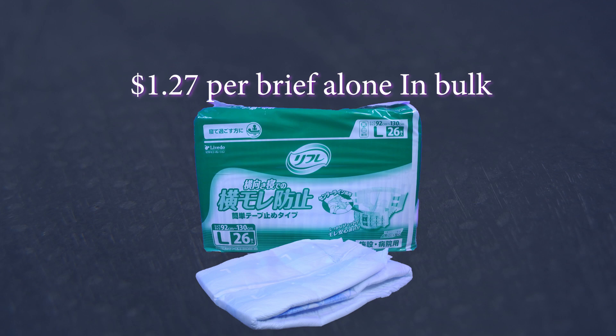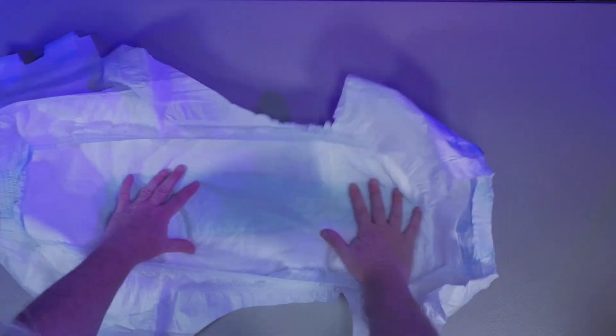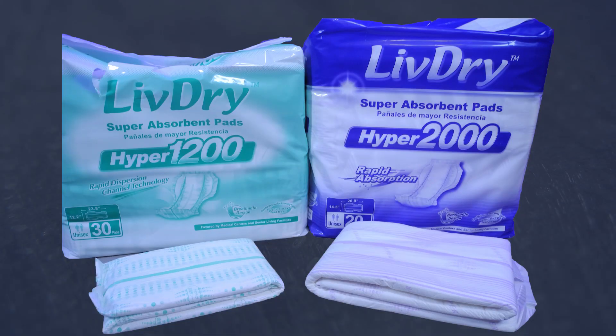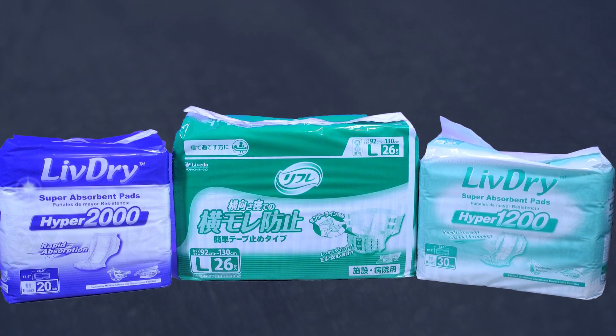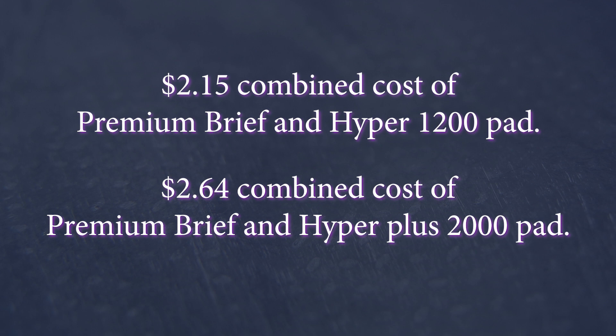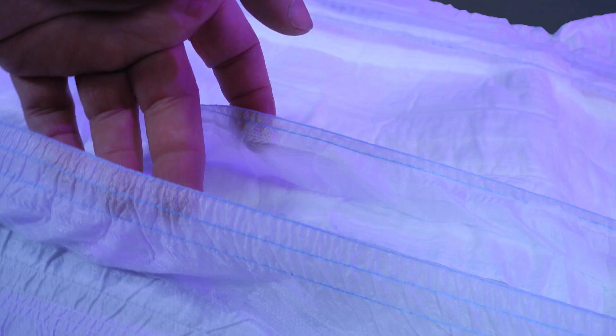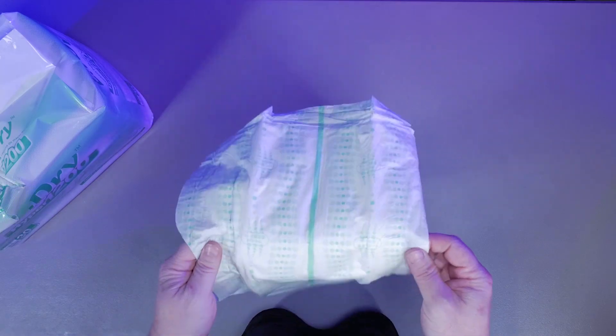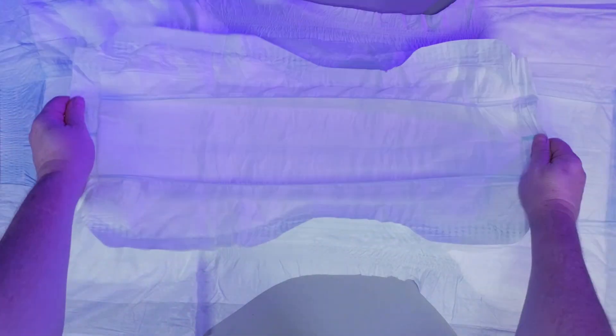At $1.27 per brief alone, the brief is lacking in absorbency and the top sheet limits its comfort. Besides the overall high quality construction and materials, it is not very usable on its own. Adding a Hyper 1200 or a Hyper Plus 2000 booster greatly improves the system's performance as designed. At $2.15 for the combined premium brief and Hyper 1200 booster, and $2.64 for the combined premium brief and Hyper Plus 2000 booster, we find a value proposition issue. High quality materials, manufacturing, and a unique design can overcome the few flaws that ultimately limit the system's performance. Improving the top sheet and adding adhesive strips to the pads, as well as bringing the cost per combination in line with the competition, will greatly improve this incontinence system's value.